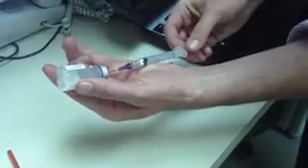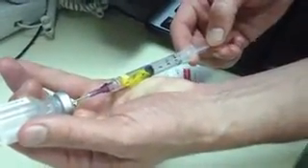You take a 3 milliliter syringe, you put on a blunt tip needle, pull out the plunger. You can take the fluorescein strip, put the fluorescein in the back of the syringe, crunch it up a little bit if you like. Take some normal saline. Pull up maybe a half to 1 milliliter of fluorescein in the syringe.